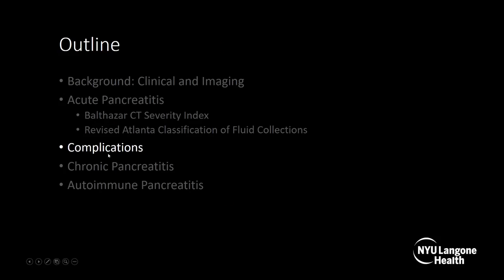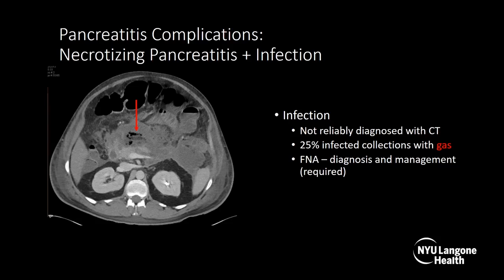Now we'll move on to complications of acute pancreatitis. On this axial CT with IV and neutral oral contrast, you can see a collection surrounding and involving the pancreas — it's heterogeneous with fluid, denser areas, and fat globules — consistent with necrotizing pancreatitis. Bubbles of air are also visible, indicating infected pancreatic necrosis. Infection is not reliably diagnosed with CT, with only 25% of infected collections having gas, so FNA is ultimately required for diagnosis and management.